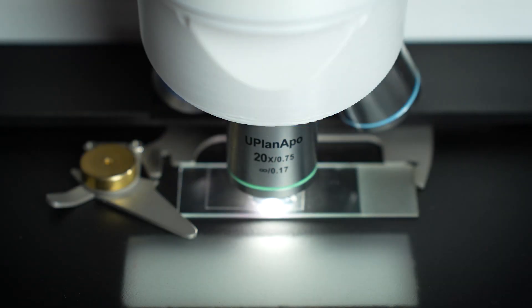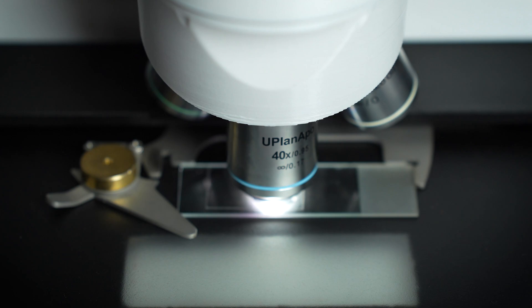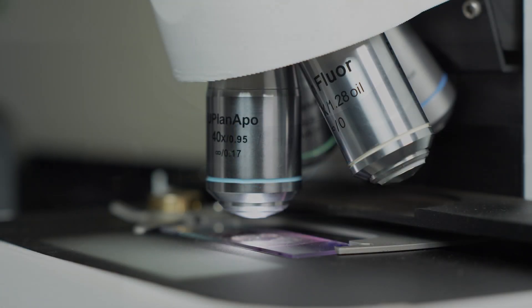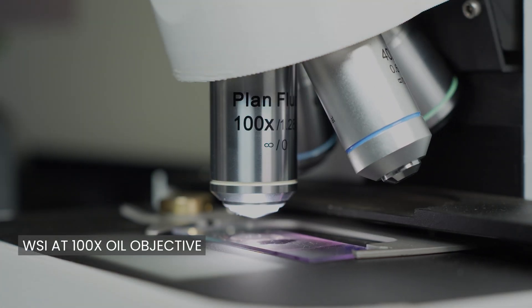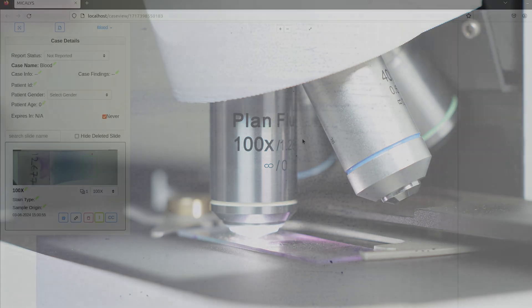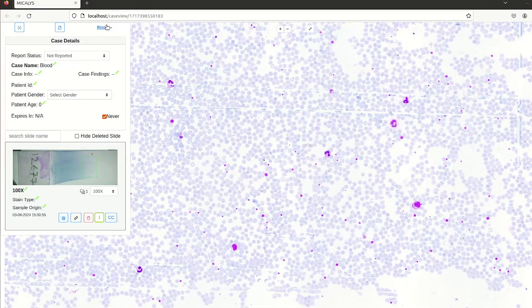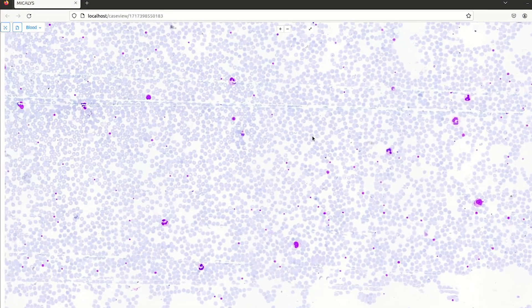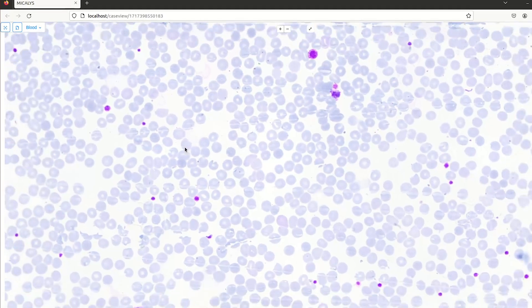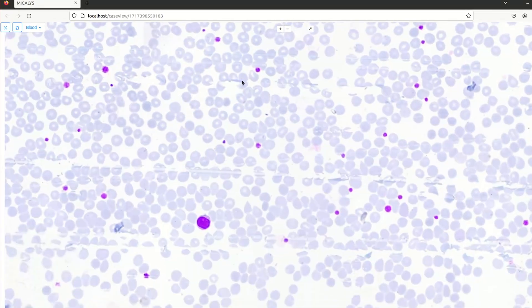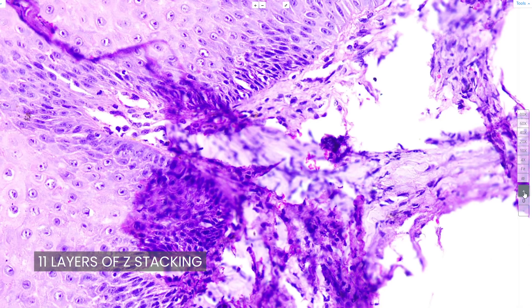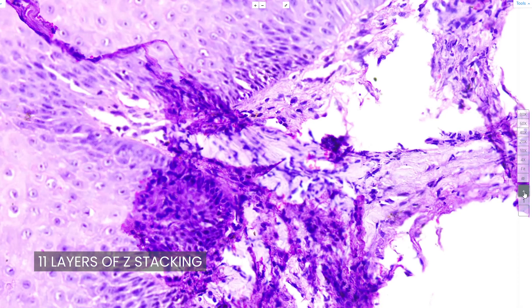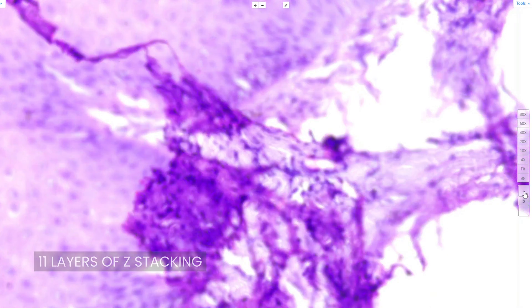Beyond standard imaging capabilities at 20x and 40x magnification, this scanner features whole slide imaging using 100x oil immersion objective. This unique offering opens up a world of possibilities, particularly for detailed peripheral blood smear analysis and also for detecting TB and malaria. Achieve stunning clarity across multiple focal planes with 11 layer Z stacking.